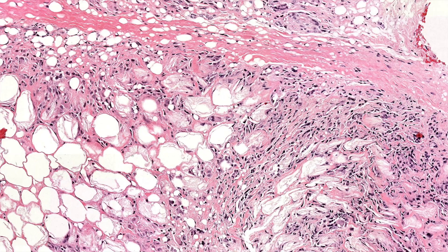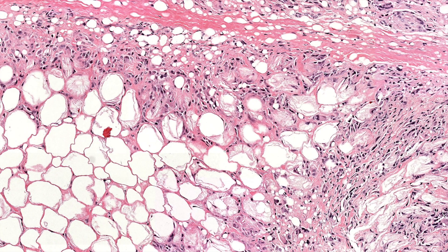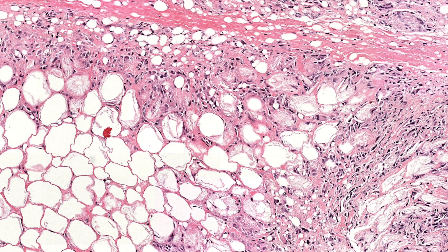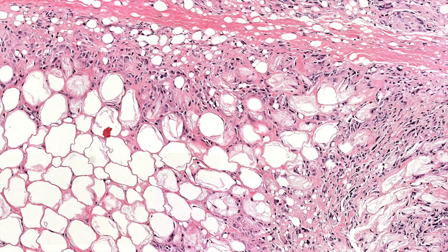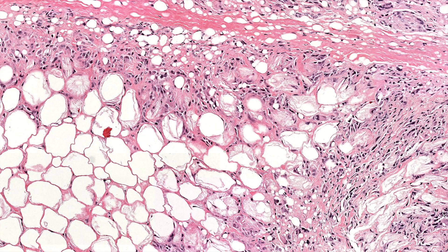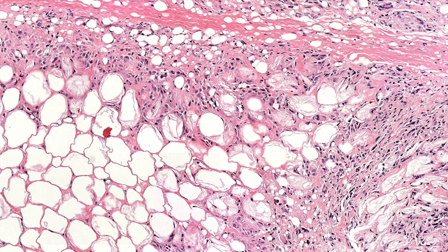Maybe I can't remember if you can see sclerema neonatorum either. My understanding is sclerema neonatorum has less actual necrosis — it's more sclerotic — and clinically those babies get these woody, firm, spreading, indurated areas.